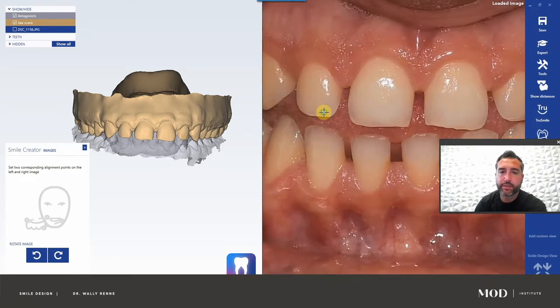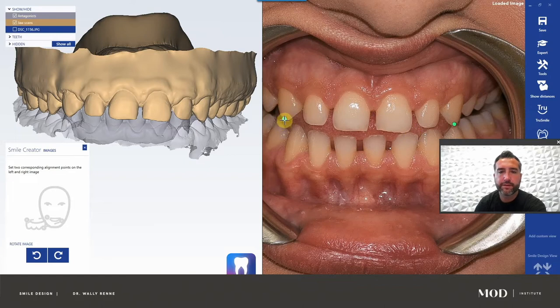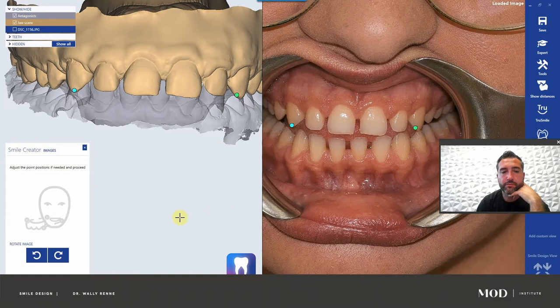You have a blue ball and a green ball. You want to separate those two balls on a coincident point on the 3D model and the 2D photograph. I usually use the cuspid cusp tips — sometimes I might go to the first premolars. Put one here; it's important that blue and green line up. Blue is on tooth six, green on the other side. You don't want to flip the blue and green because it'll flip the image. Try to be as precise as possible — pick a distinguishing feature like a wear facet. The further apart the dots, the better.